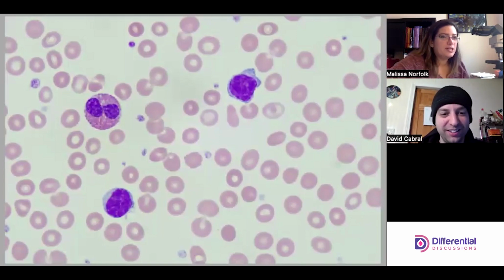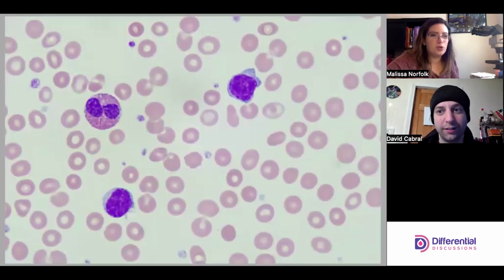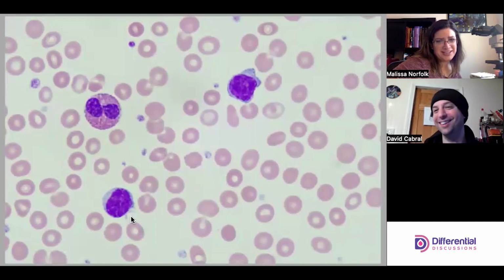Go to flow. For students, usually the slide is labeled hairy cell, and you're going to get a decent hairy cell. If it were a practical slide, it would be a beautiful, textbook sort of hairy cell and not something like this guy here.